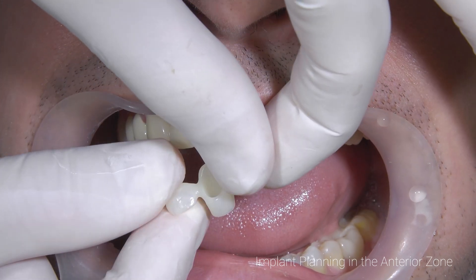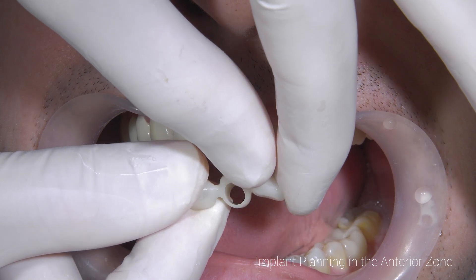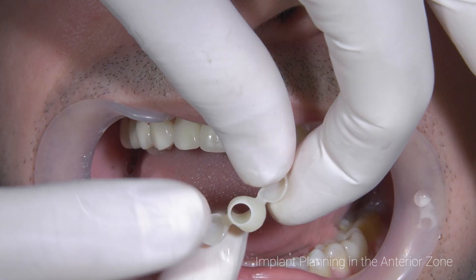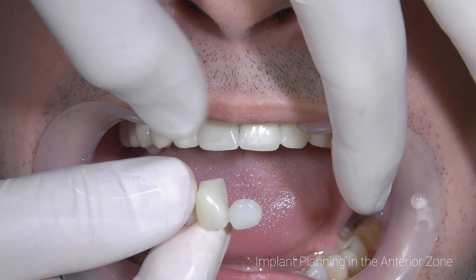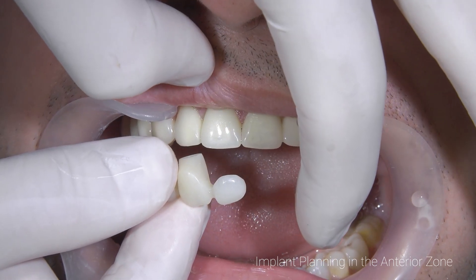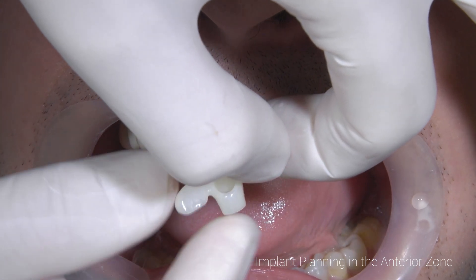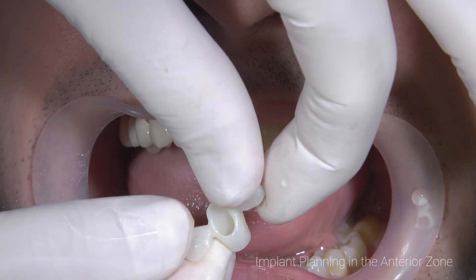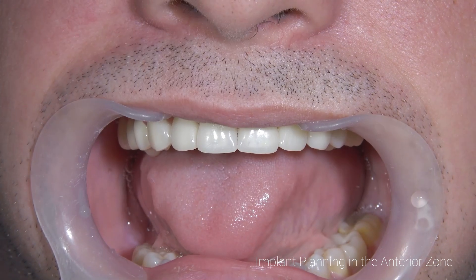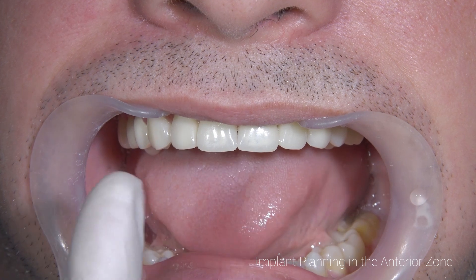We can go with the flow inside the mouth. We have space for the flowable composite, and we have the wings as you can see here. After the implant, I can put it in and with flowable composite just capture the position of the provisional cylinder with this provisional. We're going to do it step by step together, and I'm also going to scan the implant so the lab can produce a new provisional.